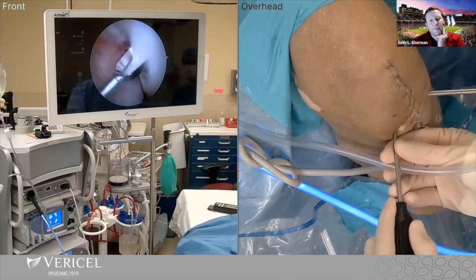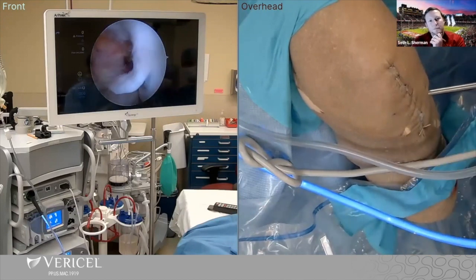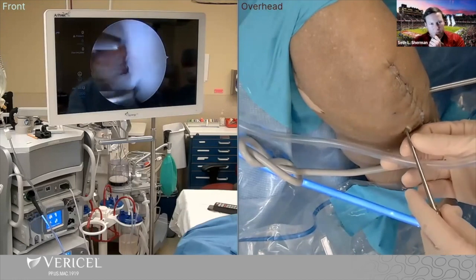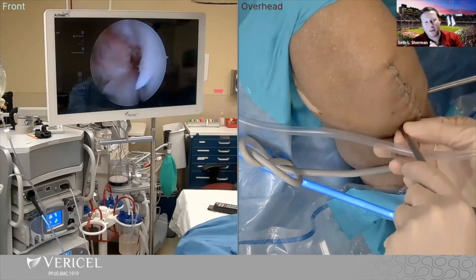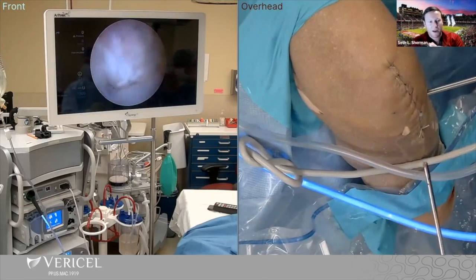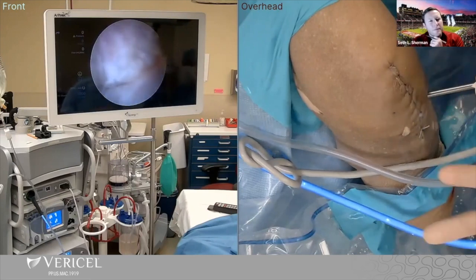As you get to the top here, you don't want to get overzealous when you're taking it, so I usually leave that little perch there. Usually you want to have two to three tic-tac-sized pieces. I've seen several hundred milligrams — a lot of the best cells are closest to the bone. So taking a little bone or seeing that bone is a critical pearl. Open it up and take that out.